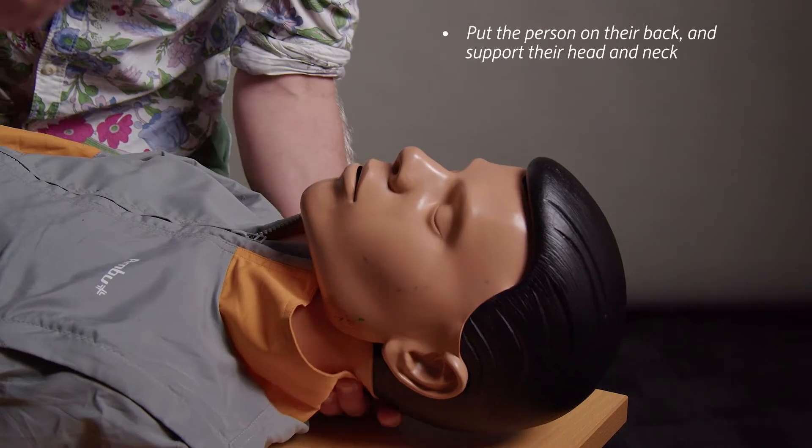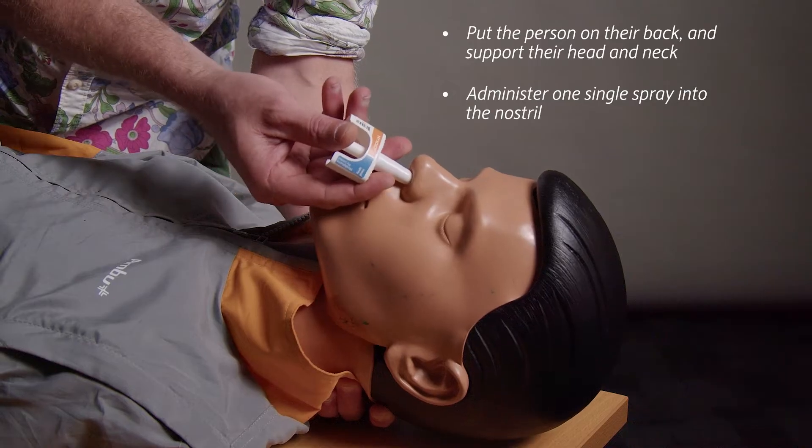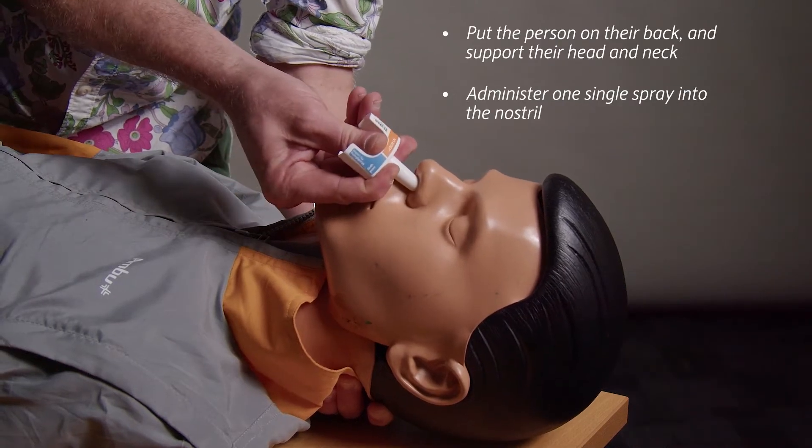Now put the person on their back and while supporting the head and neck, administer naloxone by firmly pressing the plunger as one single spray straight up the nostril until it clicks. The naloxone will be absorbed through the skin lining inside the nose.